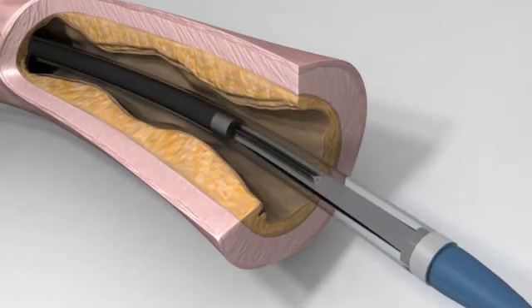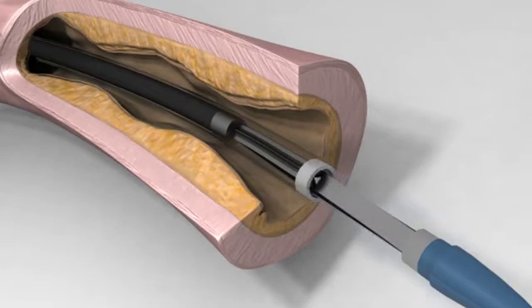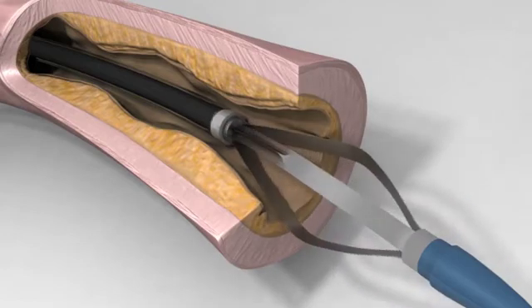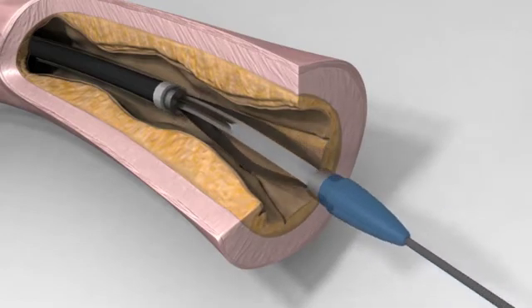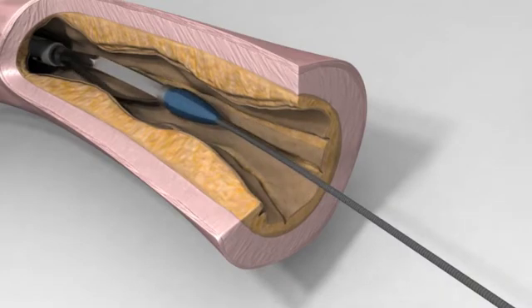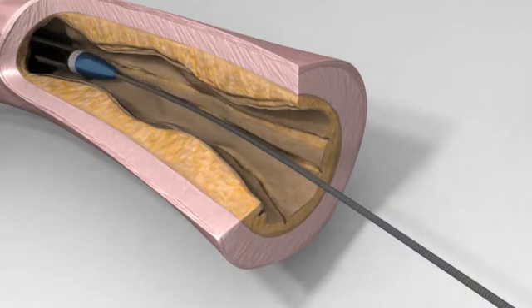You can rotate the blades to different areas in the vessel to treat. Once you finish, you can retract them and then pull them back into their housing system.